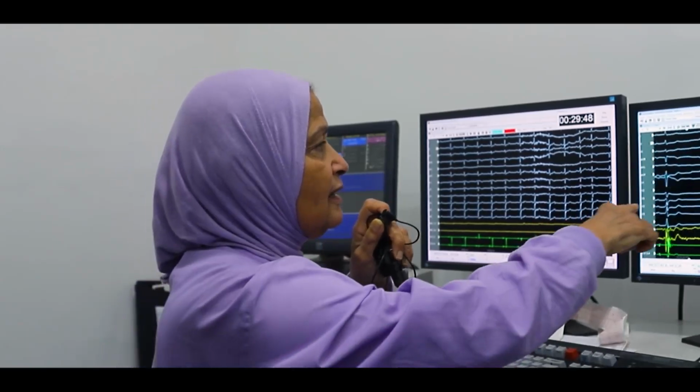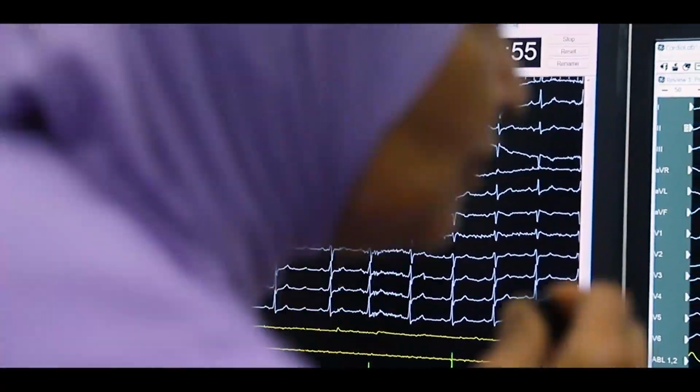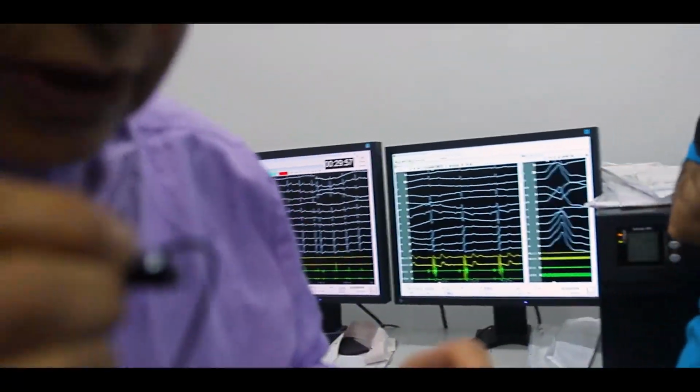Okay, very good. We have been waiting since 29 minutes 53 seconds, and we'll go to the carto to show you, and I will show you the fluoro first.